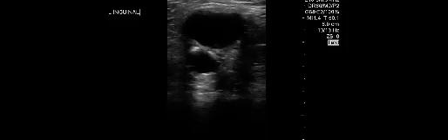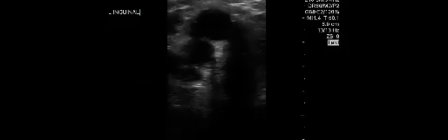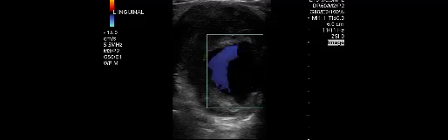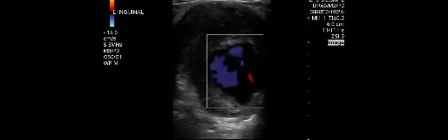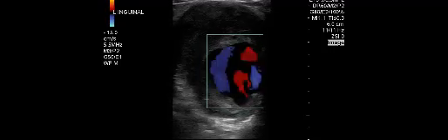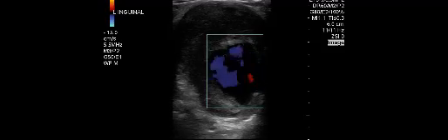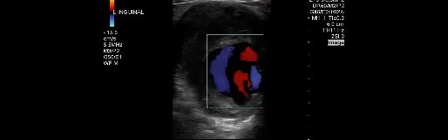As we continue to fan down more distally, we'll see that this large fluid collection is associated with the patient's femoral vessels. One of the most important parts for any soft tissue ultrasound is using color flow Doppler to make sure there's not any internal flow. When we place this over our fluid collection that we found here, we see that there certainly is flow. This leads us to believe that this is some sort of abnormal blood vessel.